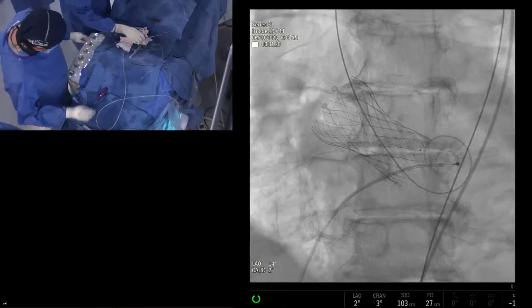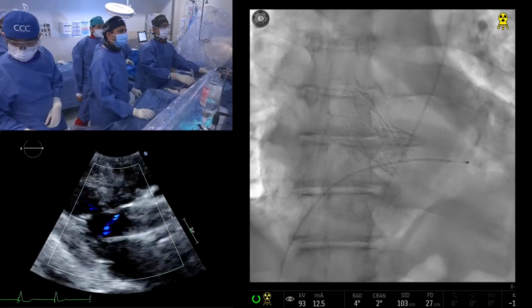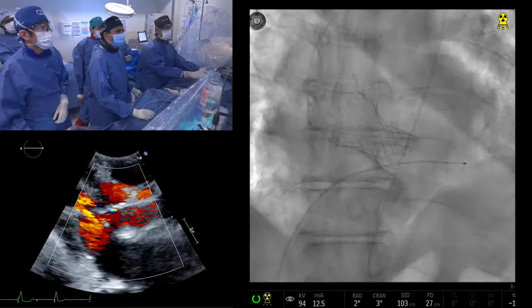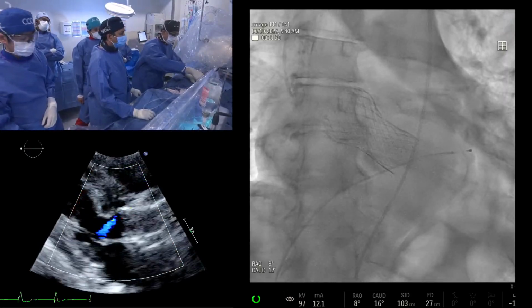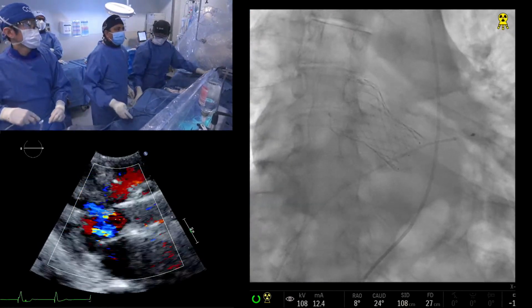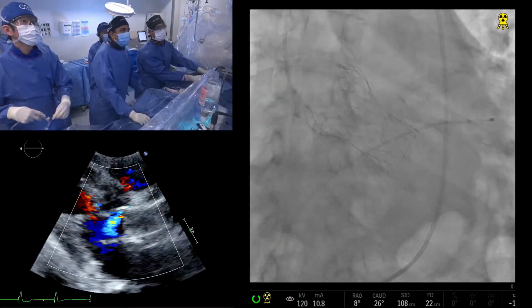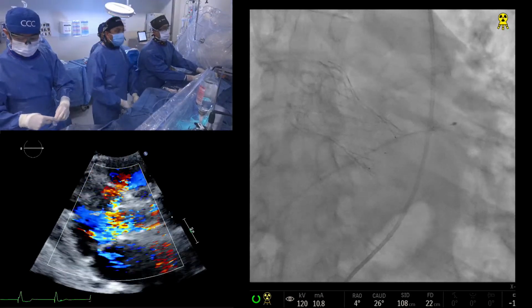But you cannot come out of the cath lab at this time with more than mild. That we learned. Mild is still all right. Of course, ideally it should be 0 or minimal, but mild is still okay. But more than mild, we should do everything possible in the lab, unless somebody is 90 plus years of age and has a limited lifespan. But somebody even 80, 82, is going to live 10 plus years, so you want the quality to come out with the mild.